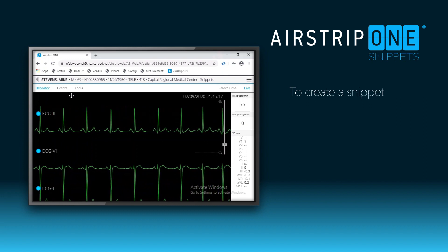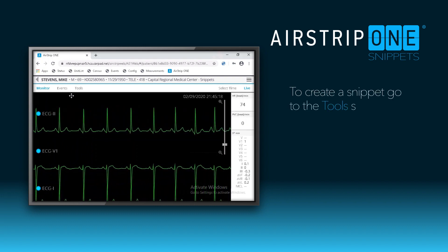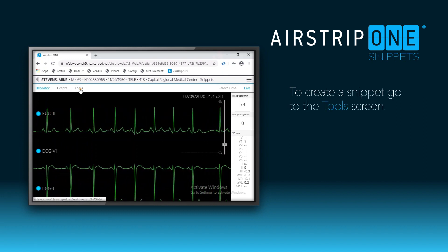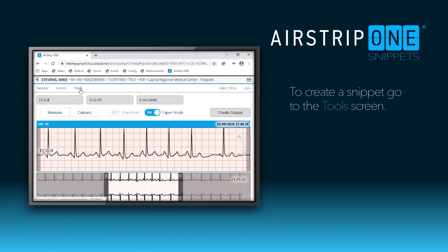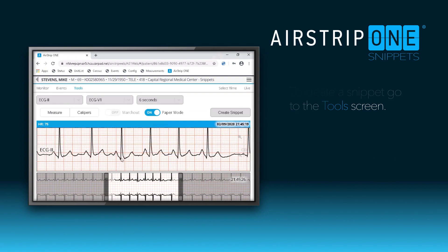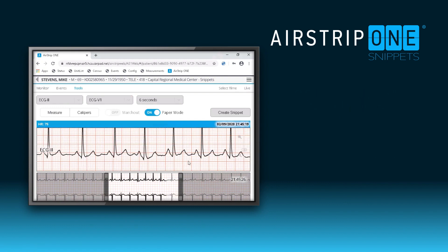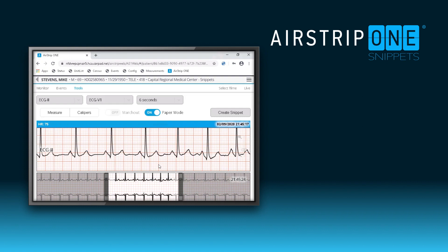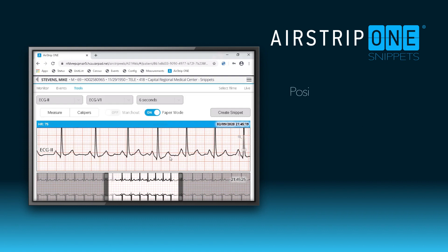To create the digital snippet, select the tools option. Adjust the strip position to the area you want to capture.